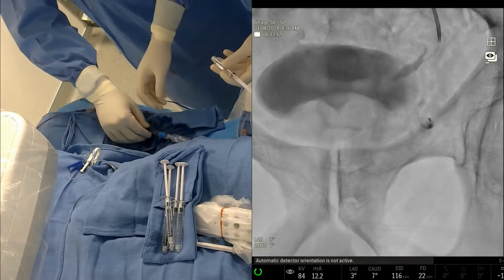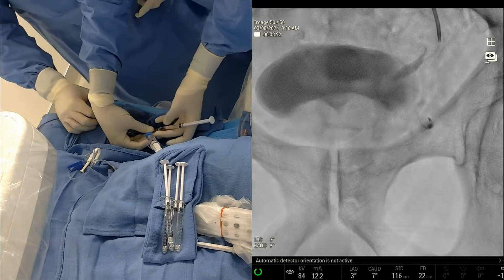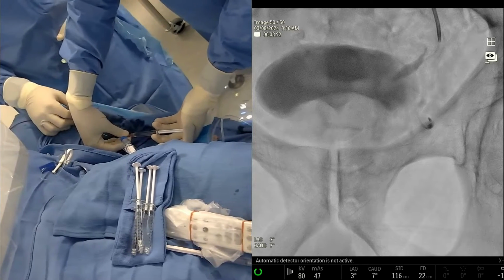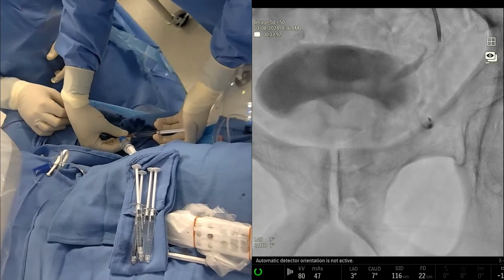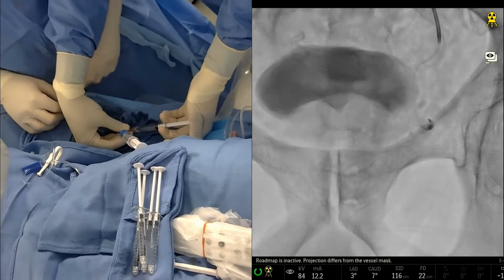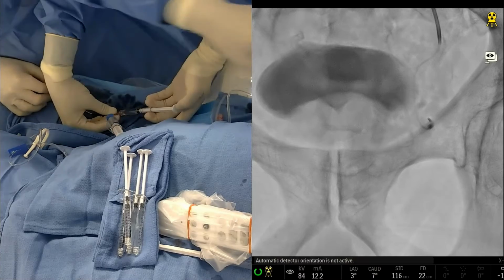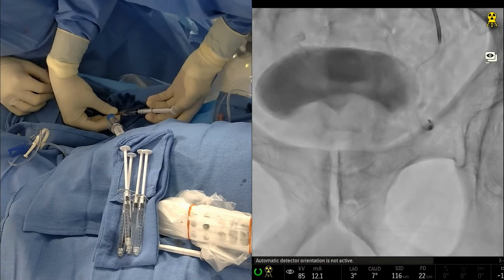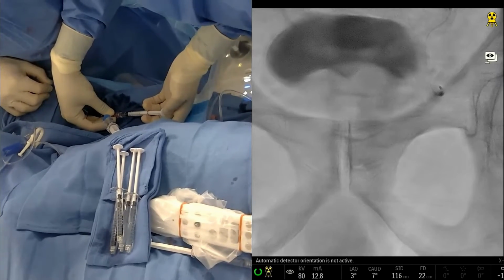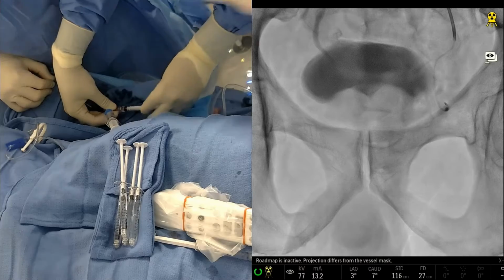This is D5. All right, so Puneet's going to flush the catheter with D5, 3 cc's. And I know we're going pretty fast here. We're going to have lots of time for discussion as we go to the other side, but we wanted to show you guys how we do this on one side, and then we can keep talking. This is really the only part of the procedure that I think is a little bit nerve-wracking, because you never know completely where the glue is going to go. But we've done this a lot, and so, slightly bigger view there, we feel pretty good about this location.